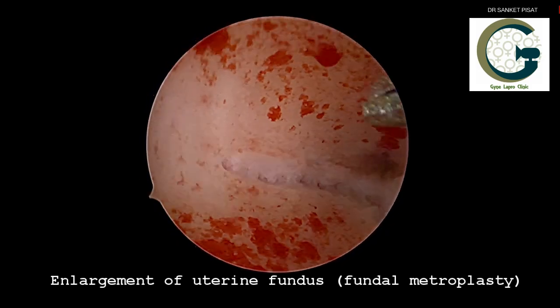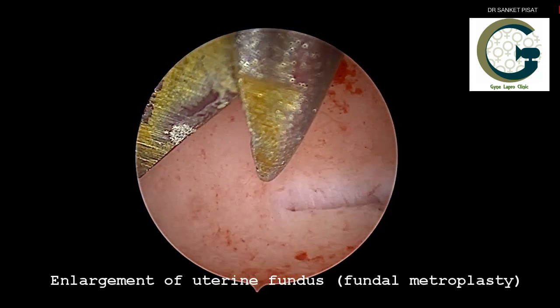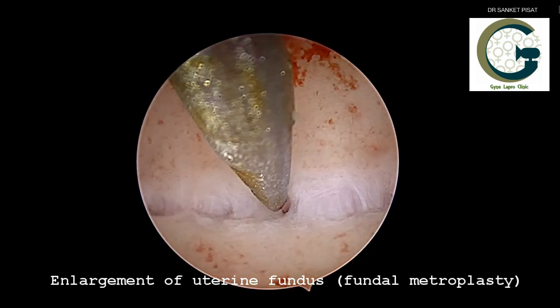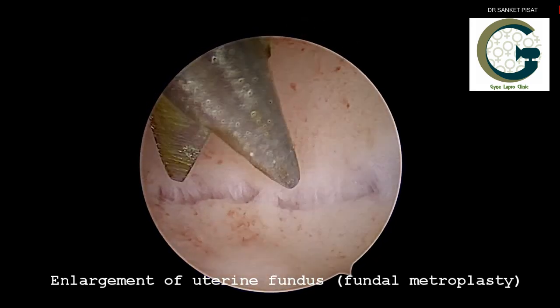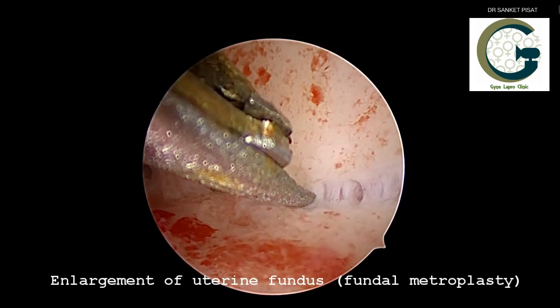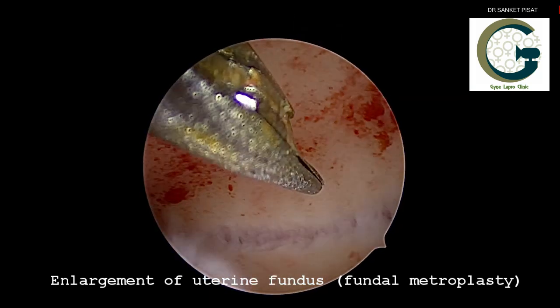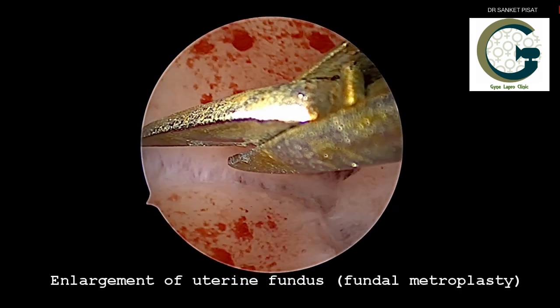Similarly, enlargement of the uterine fundus — the top of the uterus — is carried out using the hysteroscopic scissor. Using the scissor ensures minimal or absolutely no damage to the surrounding uterine musculature other than the intended area of surgery. Gradually, releasing cuts are made and the uterus is made to open up larger than it was before surgery. This also activates the endometrium by releasing certain chemicals inside, ensuring that the next time the patient attempts a pregnancy, the chances of success are much higher. We have now completed the lateral metroplasty and the fundal metroplasty, correcting two sides of the narrowing by surgery.